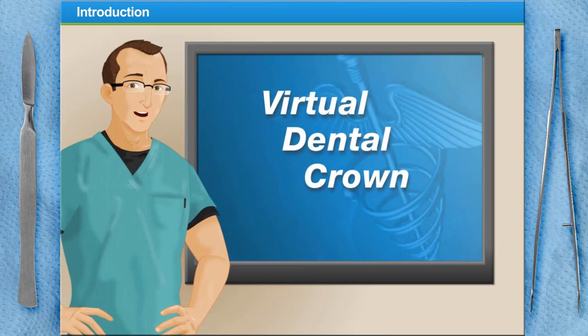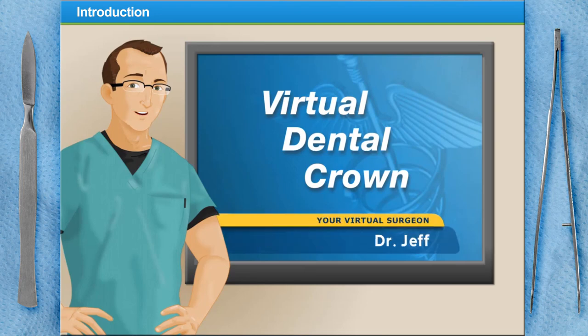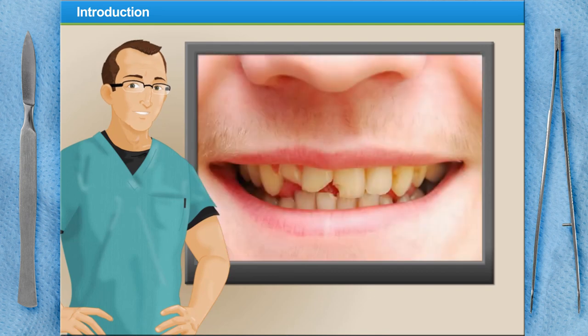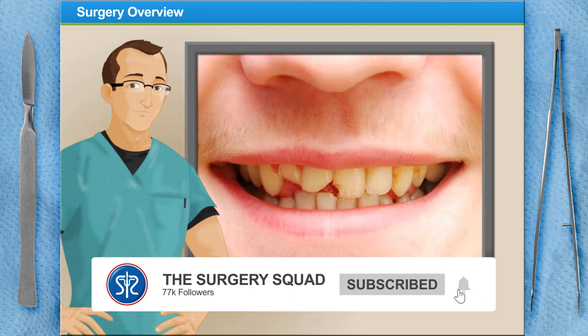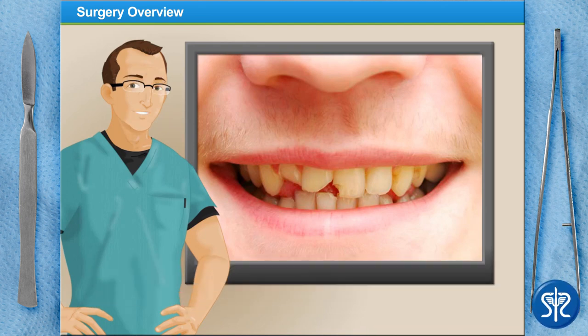Welcome to Surgery Squad's virtual dental crown. I'm Dr. Jeff and I'll be assisting you with this procedure today. A dental crown is a tooth-shaped cap that is used not only to restore the strength and functionality of a tooth but can also improve its overall appearance.